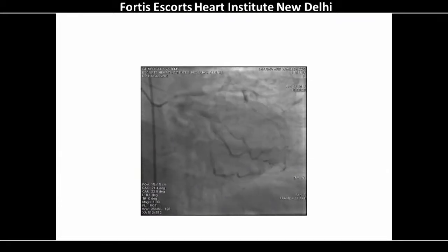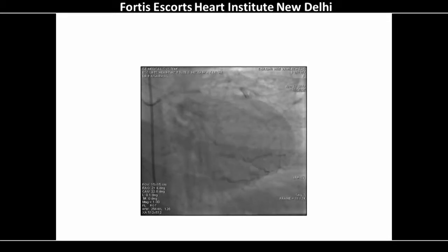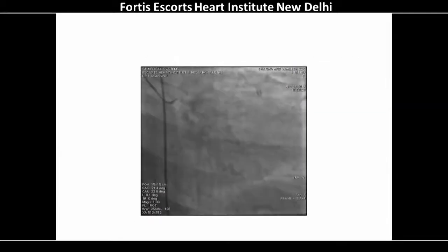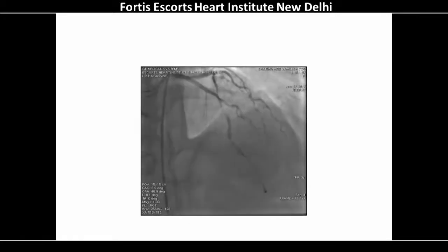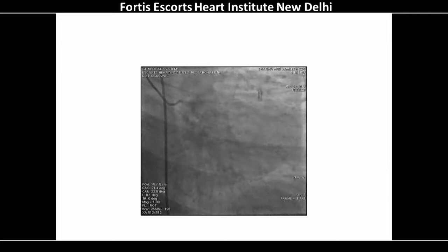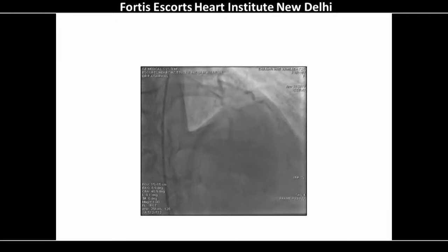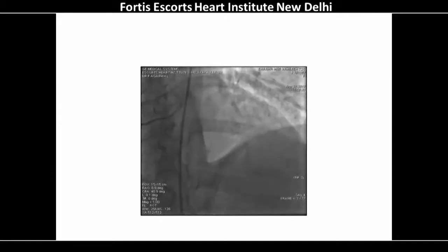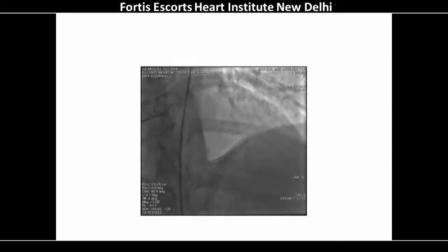The last OM, which was stented in 2007, shows a tight proximal stenosis. Next, please. And see the LAD. It shows a diffuse disease proximal to the stent, in the stent, and distal to the stent. So there is new disease involving the diag, and the proximal and distal LAD, and it is diffuse distally. But the proximal vessels are looking fine.